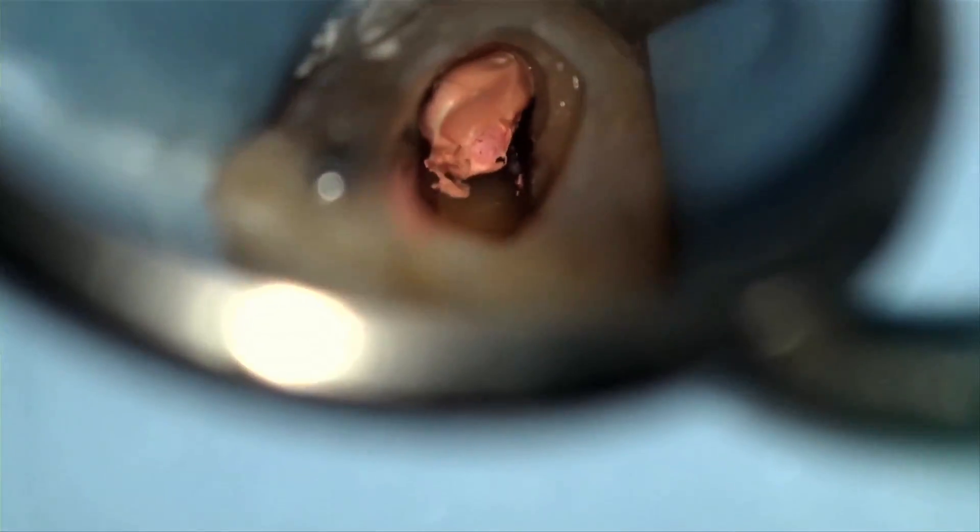But with Thermafil and other carrier-based systems, you have to use a hand piece to remove the carrier, but not so with gutta core. That, I personally found, is a great advantage of gutta core.